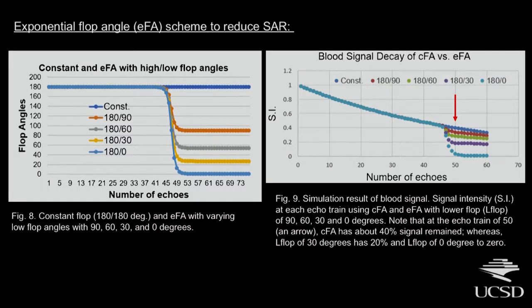Another problem is that at 3T, if the refocusing flip angle is high, then scan time is automatically elongated. We like to use 3 RR or 2 RR interval, but because of SAR it shifts to something like a 4 RR interval, so scan time is longer even though your acquisition window is short.